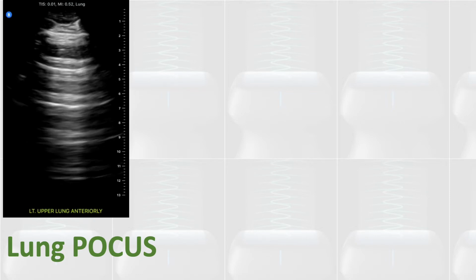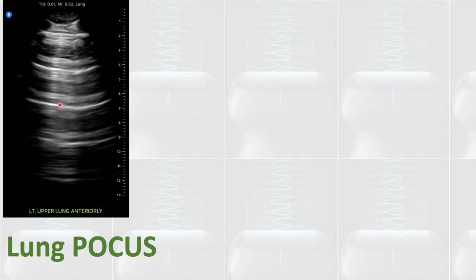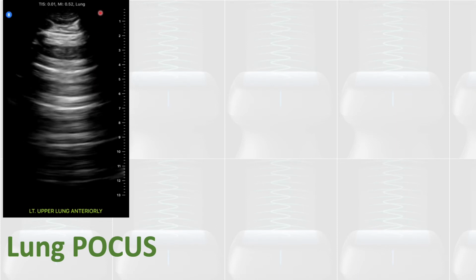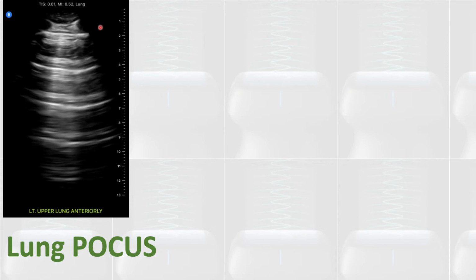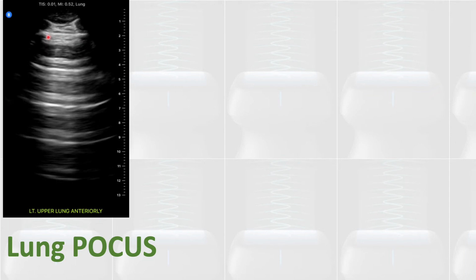Okay, regarding the findings in lung ultrasound, it's actually kind of interesting as well. So for example, here you see this patient. This is actually one of my patients who was admitted with right-sided consolidation, found to have coccidioidomycosis or valley fever. His left side was at the beginning fine, and then he started to have left-sided chest pain. So before he developed the chest pain, we were doing lung ultrasound. We saw the consolidation obviously on the right side, but the left side was relatively okay. So you see this is the pleural line. It's thin.